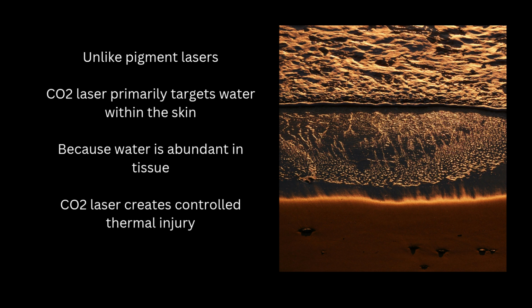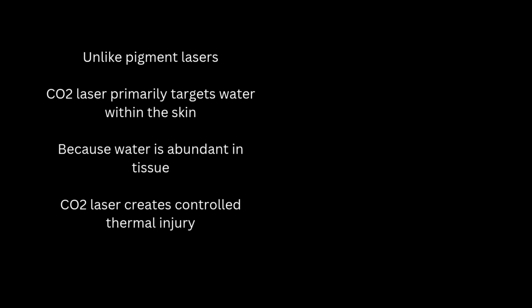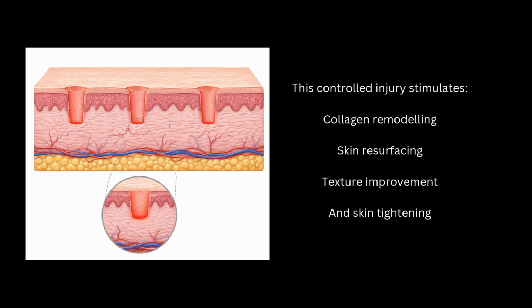Unlike pigment lasers, CO2 laser primarily targets water within the skin. Because water is abundant in tissue, CO2 laser creates controlled thermal injury. This controlled injury stimulates collagen remodeling, skin resurfacing, texture improvement, and skin tightening.